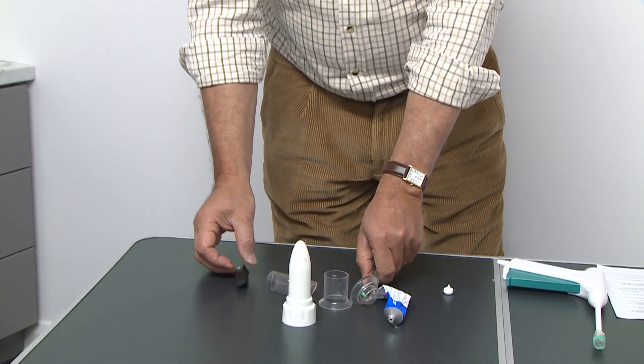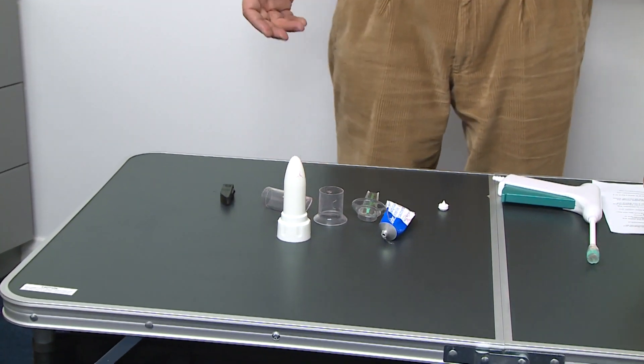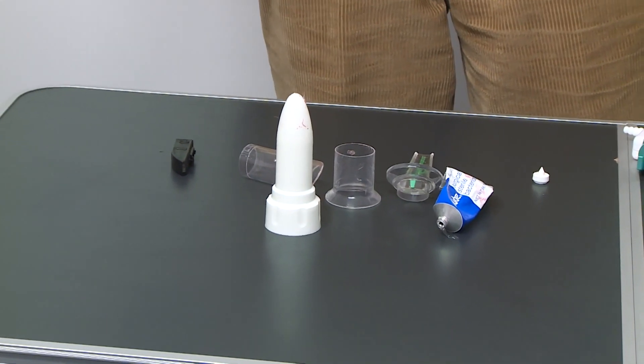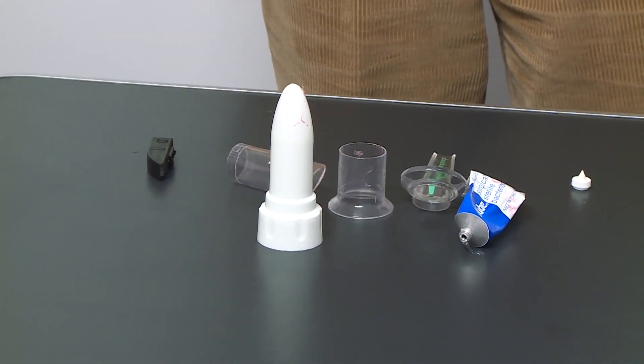I hope that I was successful in explaining how to use the proctoscope, and if you have any questions, please contact us at hemobandsurgical.com. Thank you.